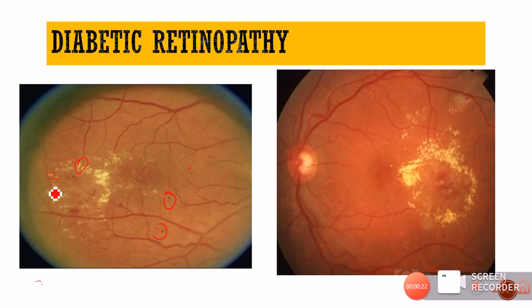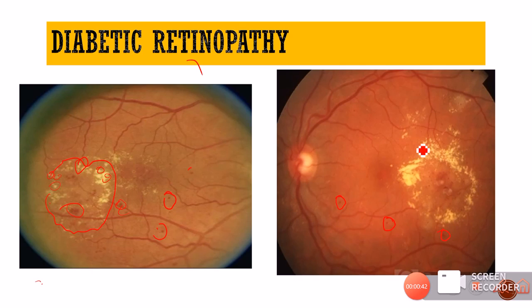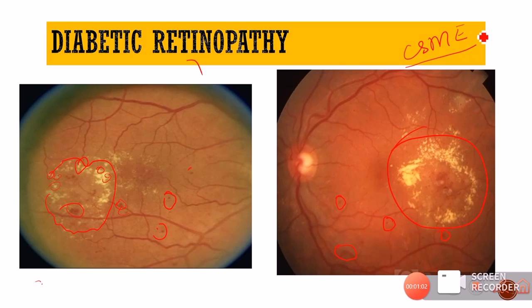These hard exudates are clumped together in the outer plexiform layer. With microaneurysms and hemorrhages present, we can confirm this is diabetic retinopathy. Similarly, in another image the macula is involved with microaneurysms, blot hemorrhages, and a ringed circinate maculopathy indicating chronic leakage — this can also be called CSME, clinically significant macular edema.